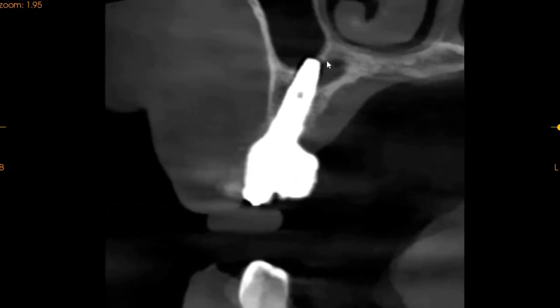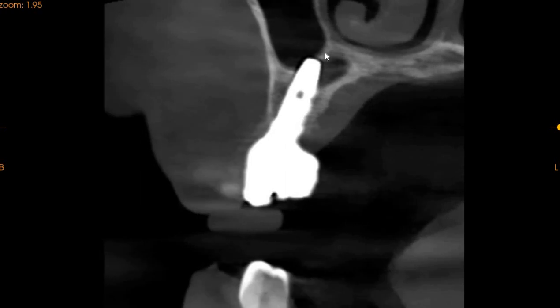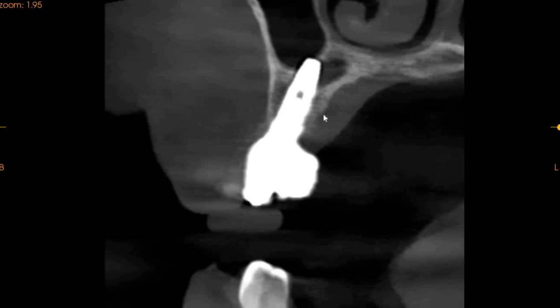Now moving to the implant — the implant is placed very well. We've got a slight radiolucency but this is the mesial aspect of the sinus. As we move further back, this could also be associated with the implant here, but it doesn't seem to be associated with the implant because we don't see any radiolucency or anything problematic with the implant.